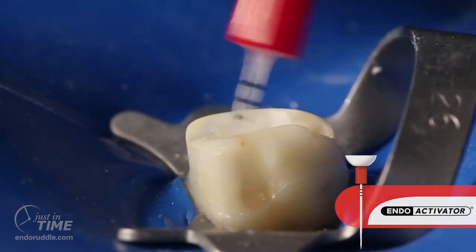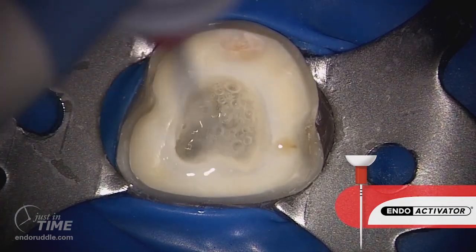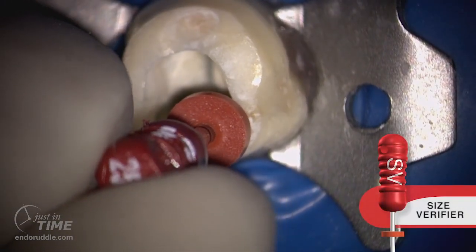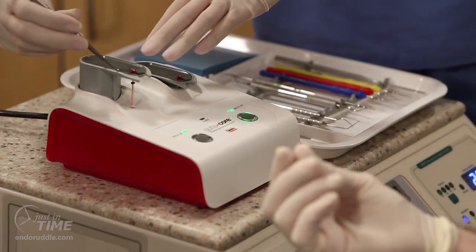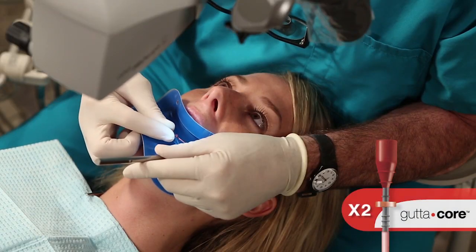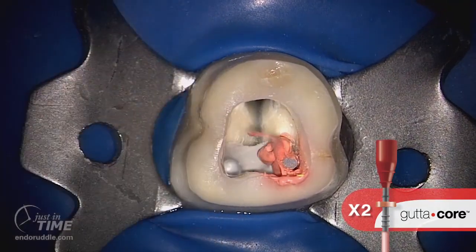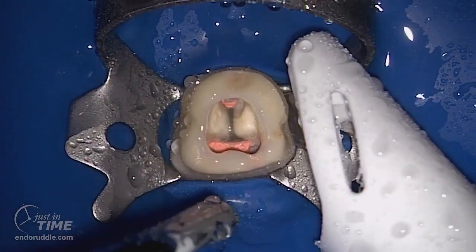It's important to recall that files shape canals, but irrigants clean root canal systems. So in preparation for three-dimensional disinfection, we can use our favorite final rinse solution in conjunction with the EndoActivator. The EndoActivator serves to exchange solution into the uninstrumentable portions of the root canal space. Here I am using a size verifier that must match the last ProTaper Next file that was carried to length. Mix the sealer of your choice and insert it into the orifices. Now we can use a gutta core obturator. Coming out of the oven, there is sufficient thermoplasticity to allow it to easily slide to length. Once this obturator has been carried to length, rock the handle gently back and forth to separate the coronal aspect from the radicular part. Fill the mesial lingual and distal systems using this exact same approach. Now flush out the tooth in preparation for provisionalization.